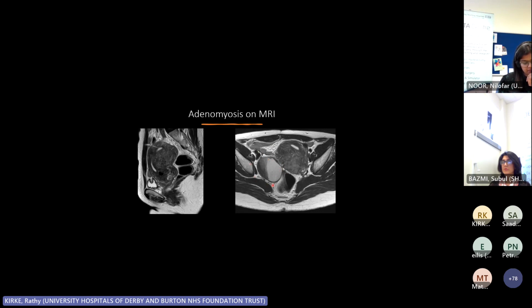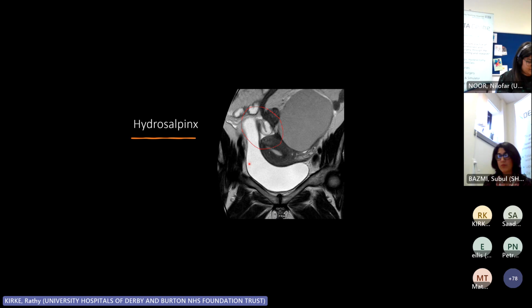We will talk about endometriomas, but they show shades of gray, or T2 shading as we call it. You've got dark gray, lighter gray, and then a much lighter gray. So if you see T2 shading in a cystic lesion in the pelvis, that is going to be an endometrioma until proven otherwise. Now, endometriosis does cause a lot of adhesions. It blocks tubes. It causes indirect signs and symptoms. So you can get hydrosalpinx. You can see this nice little tube.